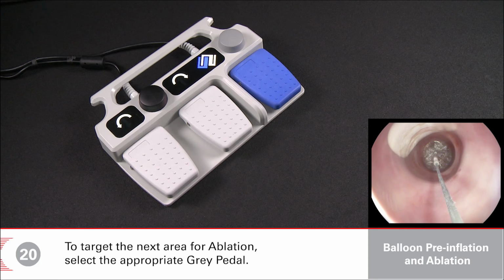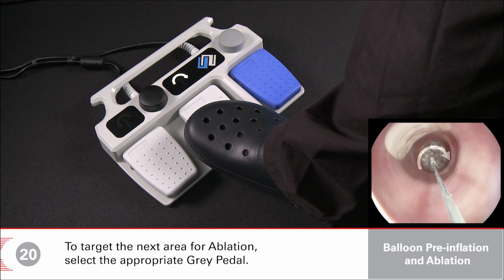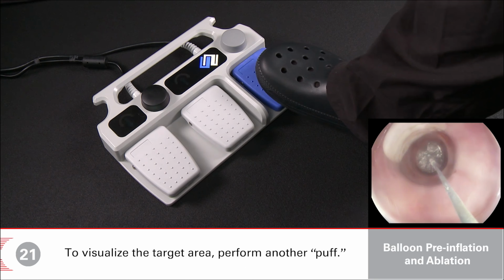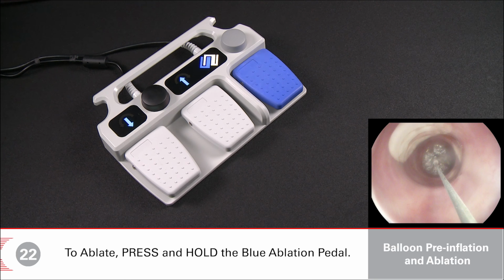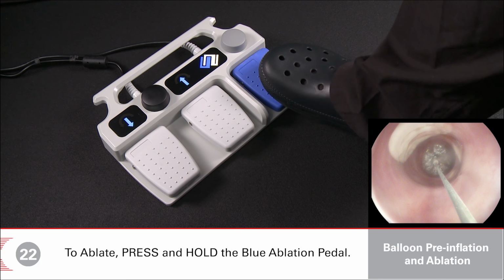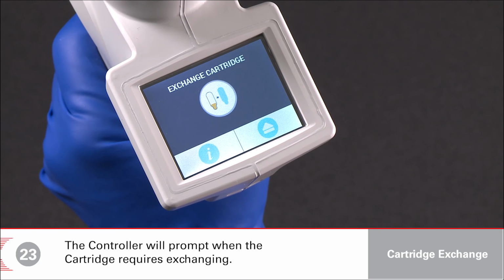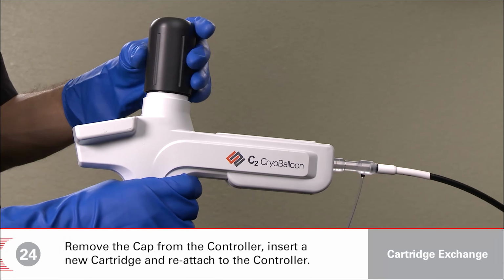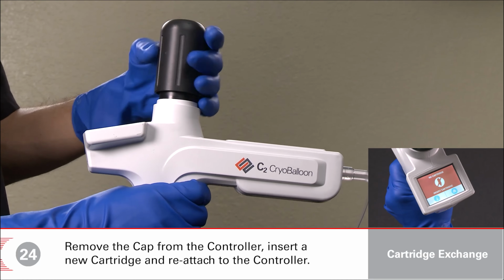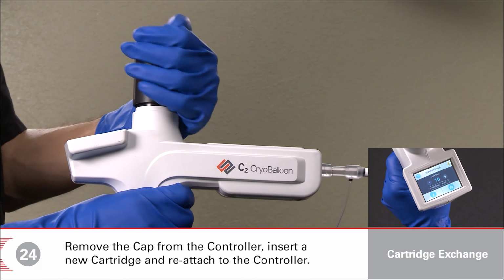To target the next area for ablation, select the appropriate gray pedal. To visualize the target area, perform another puff. To ablate, press and hold the blue ablation pedal. The controller will prompt when the cartridge requires exchanging. Remove the cap from the controller, insert a new cartridge, and reattach to the controller.